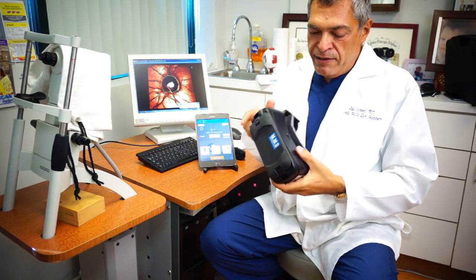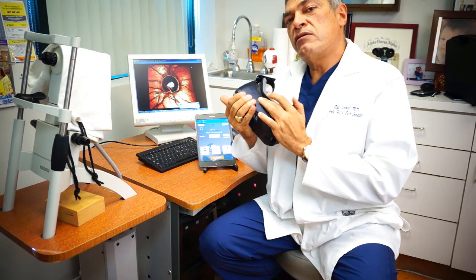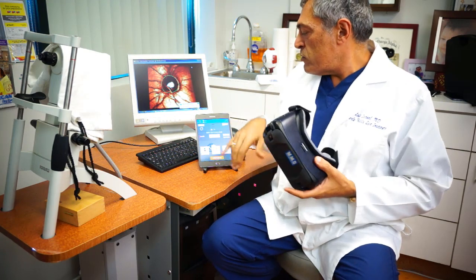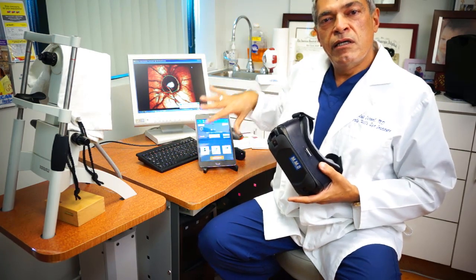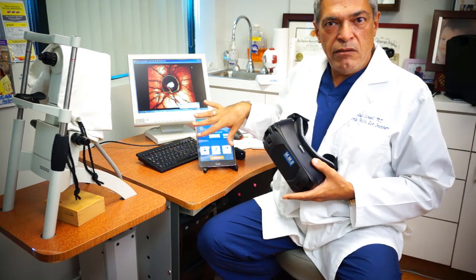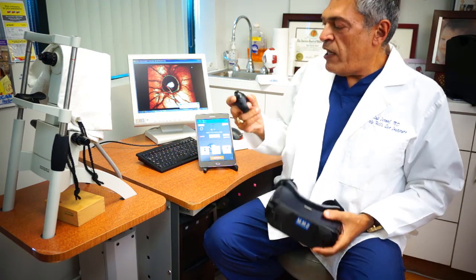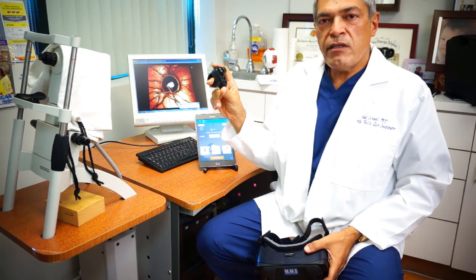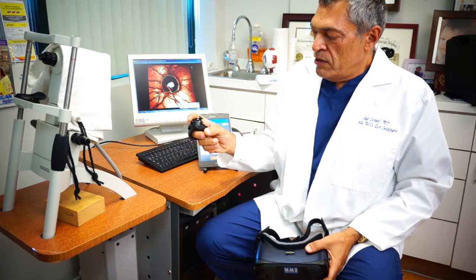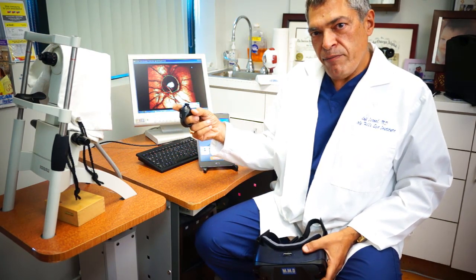The device has a focusing mechanism built in, so you can focus from plus one diopter to minus six diopter. You can also set the focus on the control module, and the patient will interact with the machine with a Bluetooth controller — whenever they see the stimuli, they will be pressing the button.